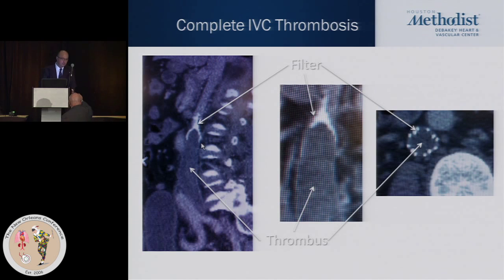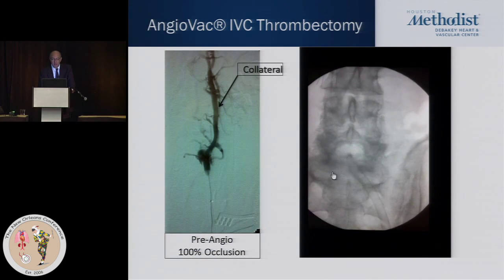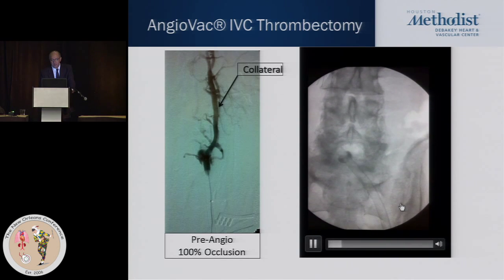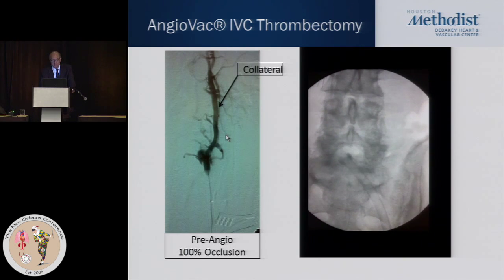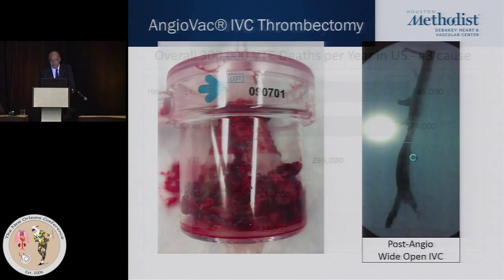This is the IVC filter that's in place. Here you see the IVC filter in place, and below it the inferior vena cava is completely clotted off. An AngioVac was used — you see the device being placed from the left common femoral vein. This is what the angiogram looked like before the AngioVac evacuation, this is what was obtained from the inferior vena cava, and this was the completion angiogram showing a wide-open inferior vena cava.